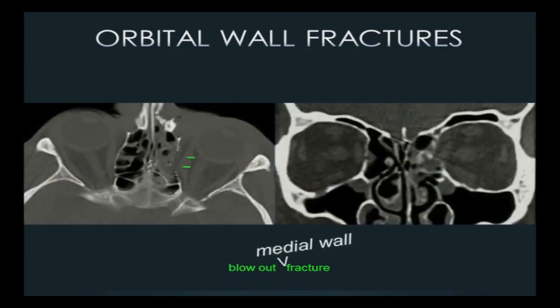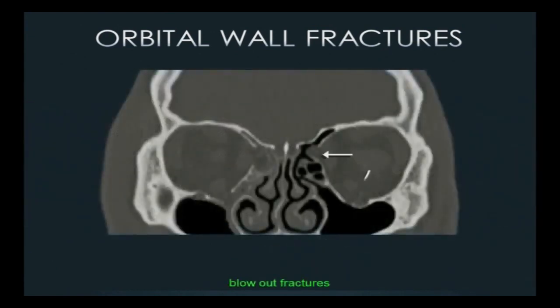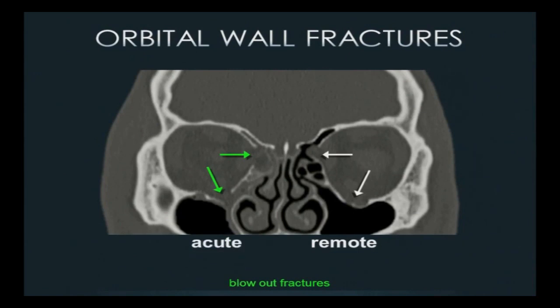We can have patients with both medial orbital wall and floor fractures. On the patient's left side with no hemorrhage in the sinuses, that's the remote fracture. But it's a Saturday night in New York, so we have the matching acute injury on the patient's right side. He was hit by a lefty tonight and by a righty before — our typical Saturday night special.